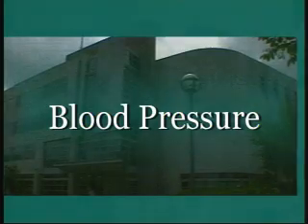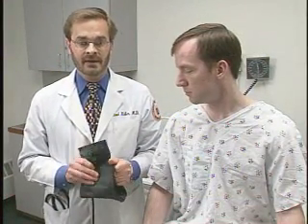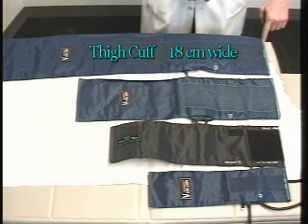You, of course, need a sphygmomanometer with a blood pressure cuff. And of course, a blood pressure cuff is not one size fits all. The largest blood pressure cuff is known as a thigh cuff, although this can be used on a patient who has a very large arm.